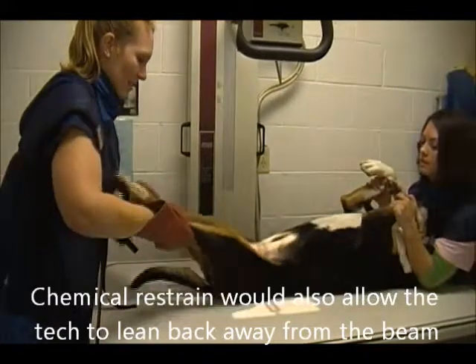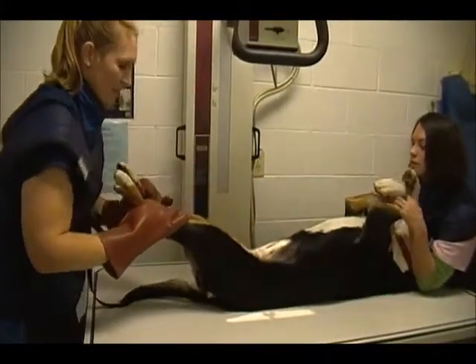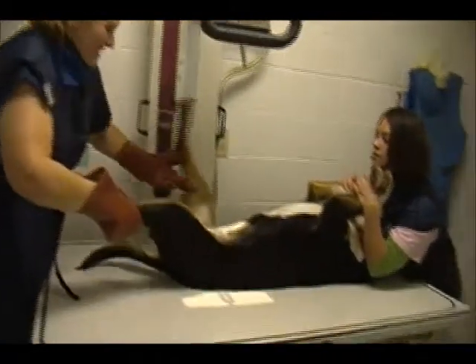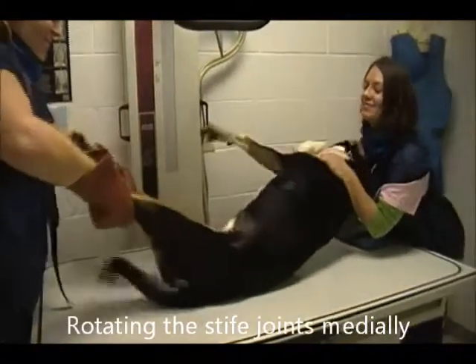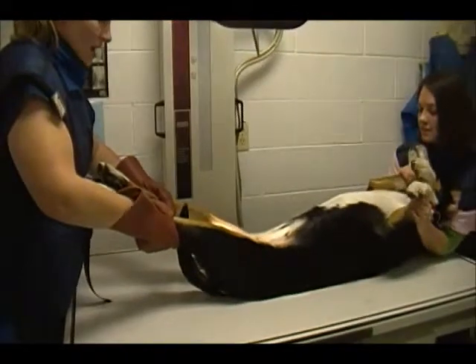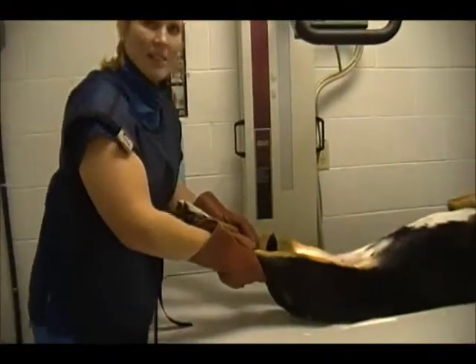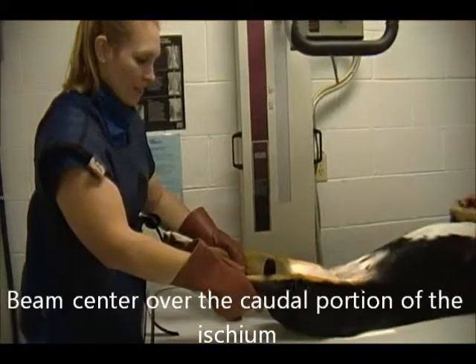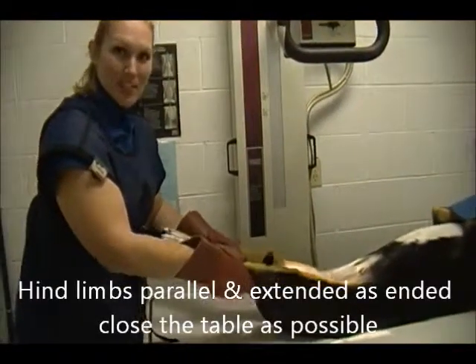While taking this radiograph we make sure that we extend the hind limbs and rotate medially a bit. We want to include the ilium and the patella in this radiograph. Normally we would make sure that the limbs were extended as parallel and close to the table as possible, but since she's not sedated I'm not going to push it.